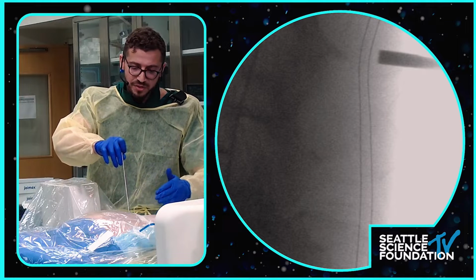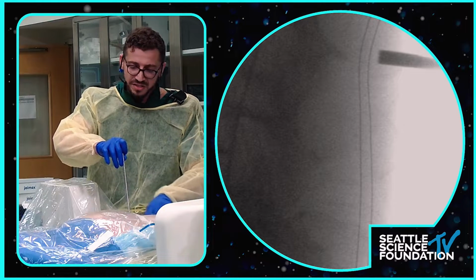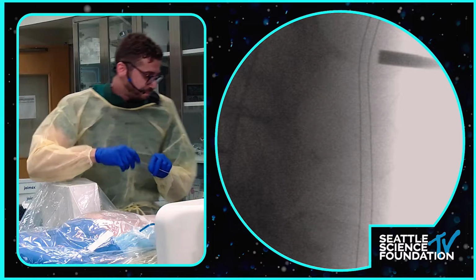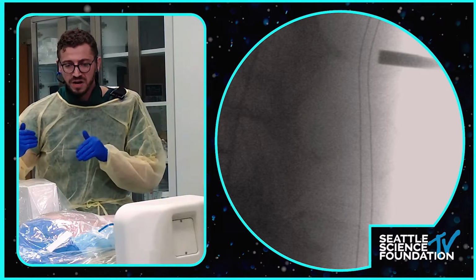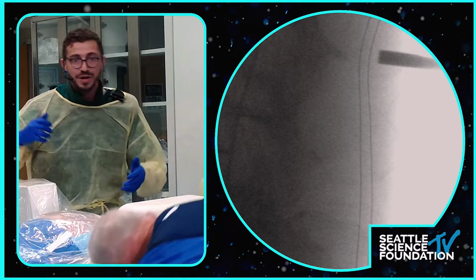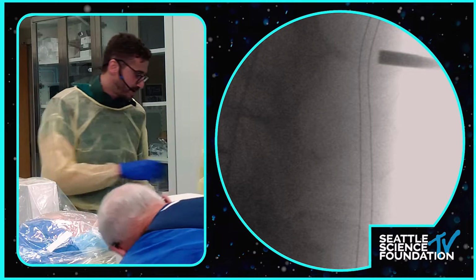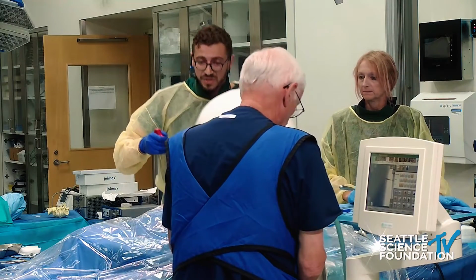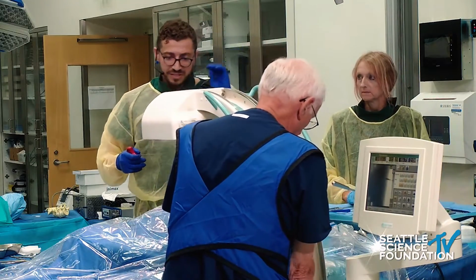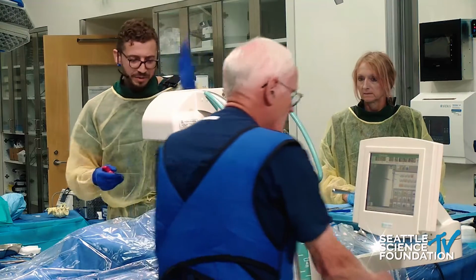And based on the checkpoints we said earlier, between 10 to 12 centimeters, and here it's actually perfectly on the 10 centimeter line. So now that we have our approach angle, and how far we want to start, we start this process. If you can go back to AP, please. In the AP, again, it's important to get a perfect AP. So you have to wag it either cranial caudal to get a perfect AP, and we ended up having to wag it a couple of degrees.